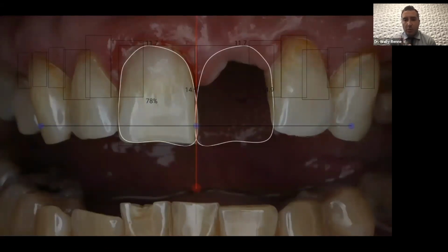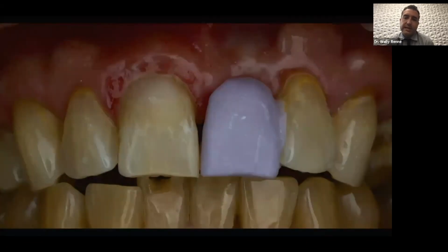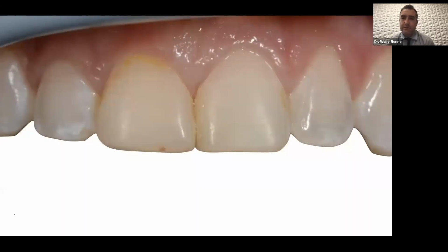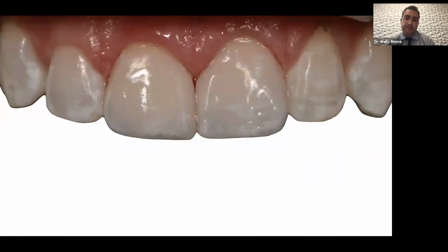And so I morphed the tooth about 1 millimeter to know how much I needed to take off so that we could have a symmetrical pontic between 8 and 9, so we could get that shape and size correct for this patient. Sometimes you do break it out for the single unit, but not often, and typically not even for 2 units. Like in this case, really didn't need the Smile Design software for these veneers. This is immediately after delivery on this young lady.